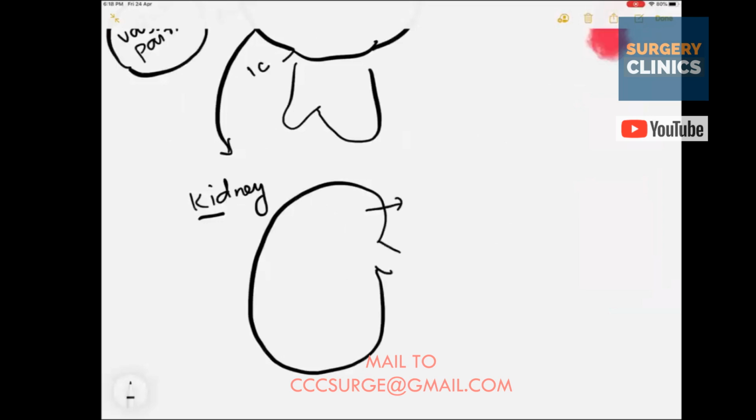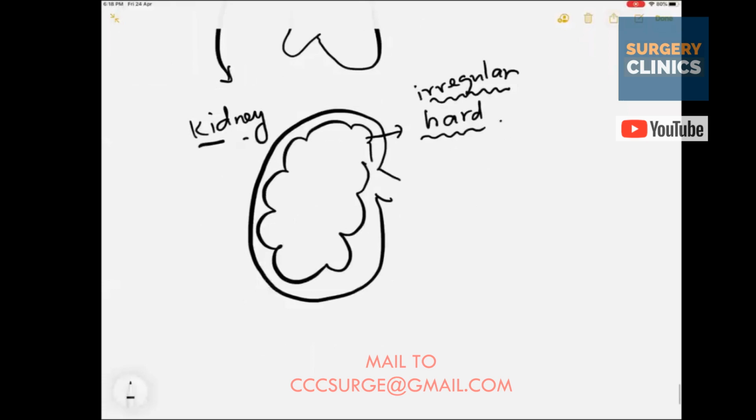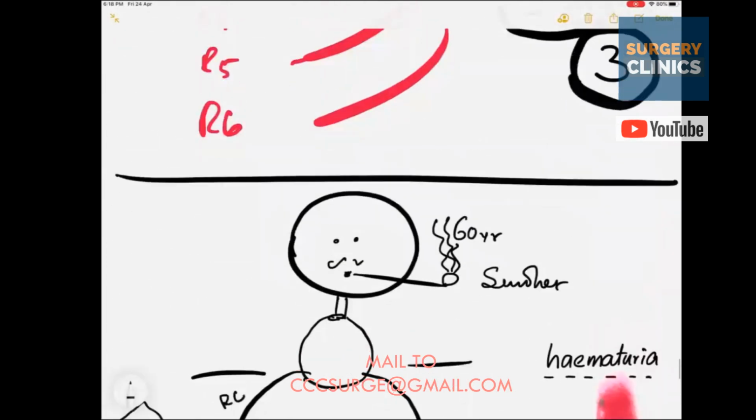The surface is irregular and the consistency is hard. That makes you think, what do I have with me now?